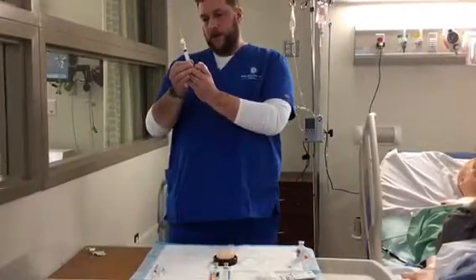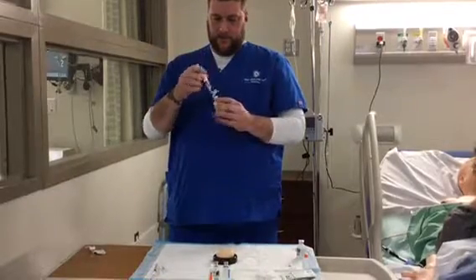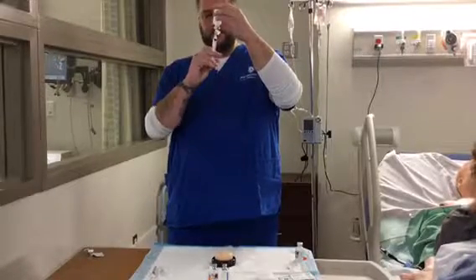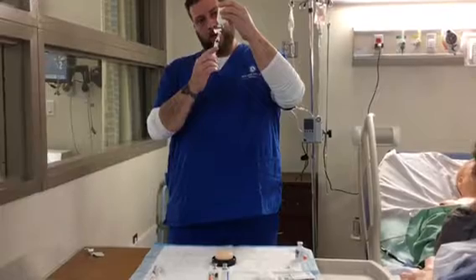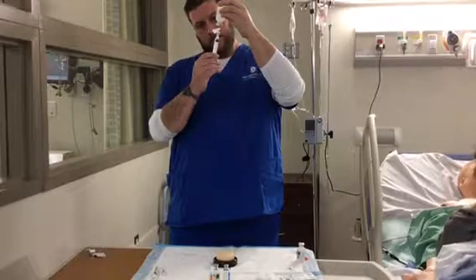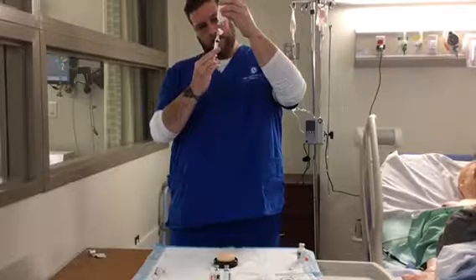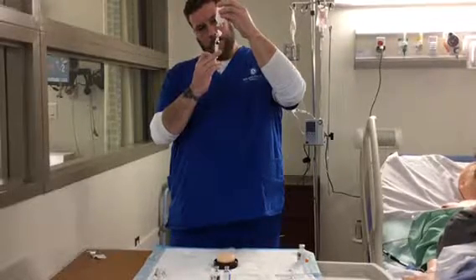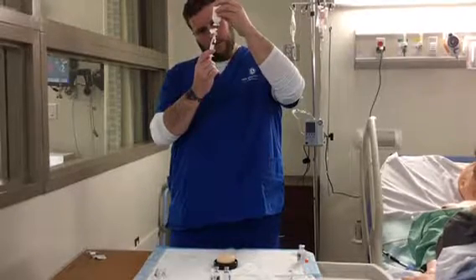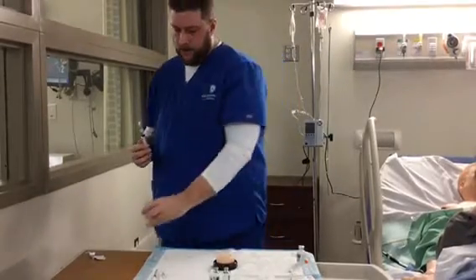You would withdraw 2 milliliters of air, insert into the vial, expel the 2 milliliters of air, and then withdraw the 2 milliliters, making sure not to get any air bubbles. Again, making sure that there's no air bubbles.